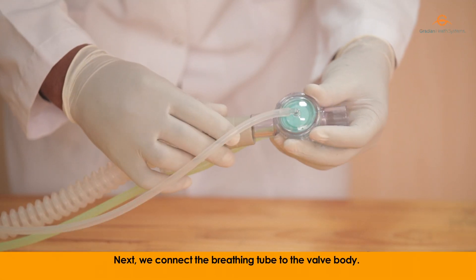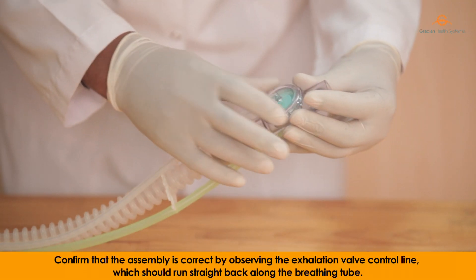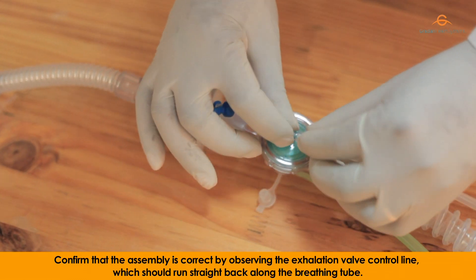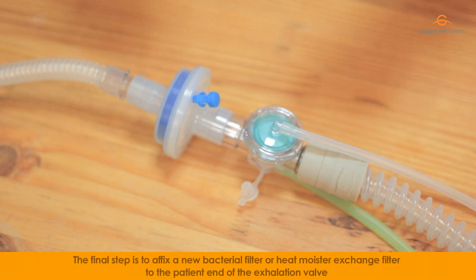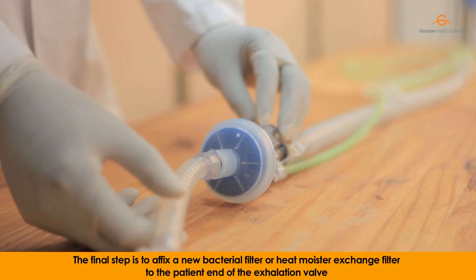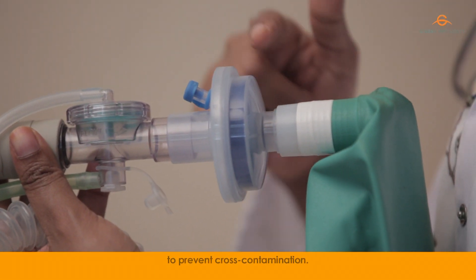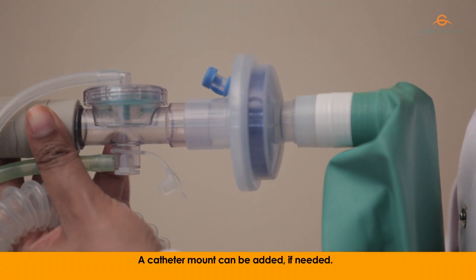Next, we connect the breathing tube to the valve body. Confirm that the assembly is correct by observing the exhalation valve control line, which should run straight back along the breathing tube. The final step is to affix a new bacterial filter or heat moisture exchange filter to the patient end of the exhalation valve to prevent cross contamination. A catheter mount can be added if needed.